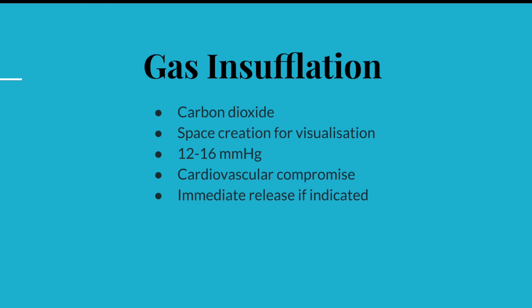Carbon dioxide is the gas of choice as it is inert, non-inflammable, as well as its solubility to allow excretion via expiration. Accepted range of insufflation pressure is between 12 to 16 millimeters of mercury. The point of note is that pneumoperitoneum can cause cardiovascular compromise manifested as hypotension or bradycardia via a reduction of venous return. If this is the case, pneumoperitoneum should be deflated until the anesthetist deems it safe to proceed.